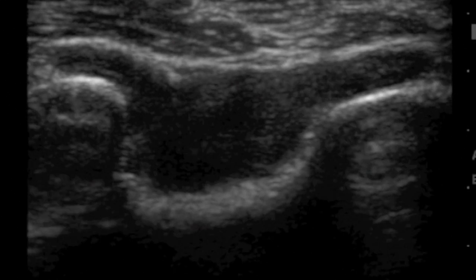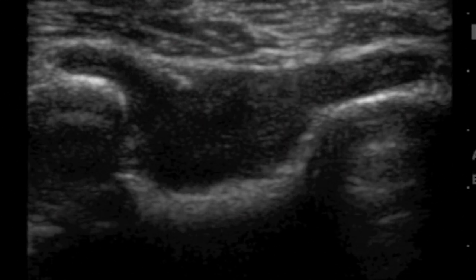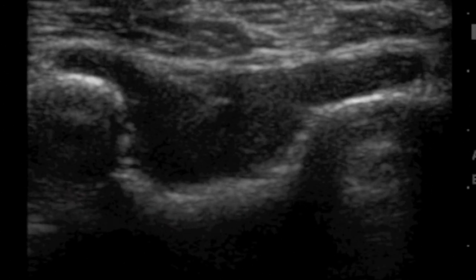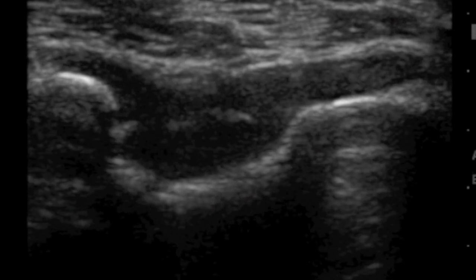In this elbow effusion, the posterior fat pad has been displaced out of the scan plane so we can't see it. Instead we see a pocket of fluid that rises above the intercondylar line — this is an effusion on ultrasound. And that is a needle actually being guided under ultrasound for arthrocentesis.